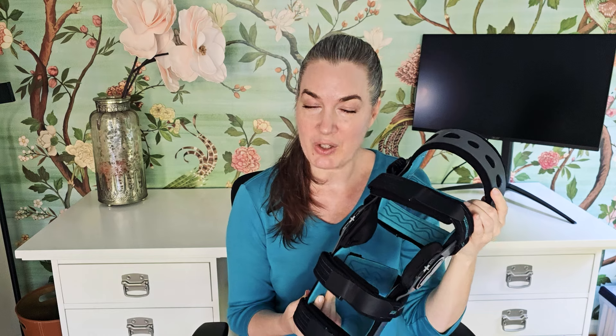Comzer was nice enough to send me this ACL knee brace in exchange for my honest opinion. It's got these adjustable hinges as well as a bunch of ways to customize and personalize it. I'm going to do an up-close demo so you can see exactly what it looks like in person, as well as a try-on.